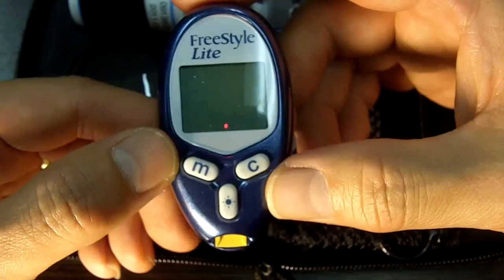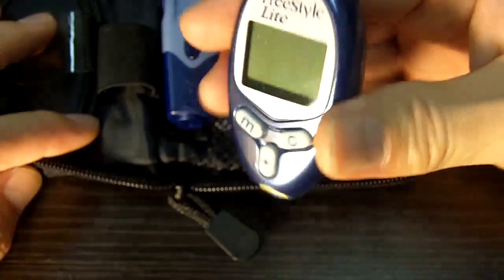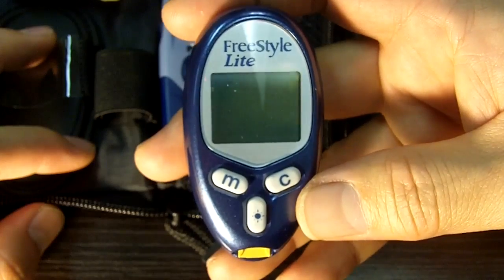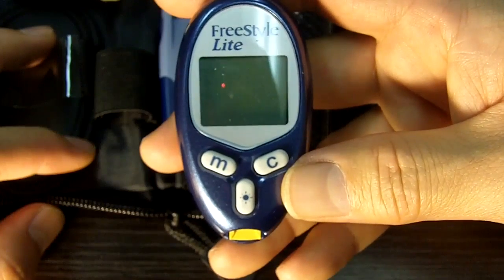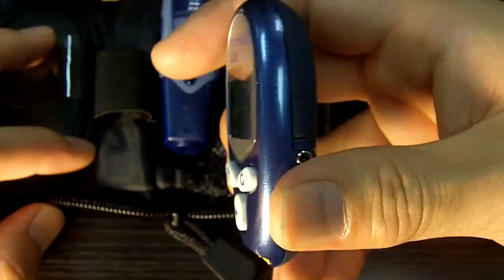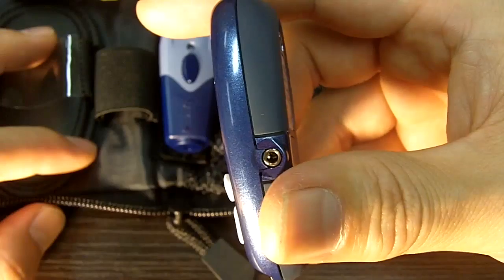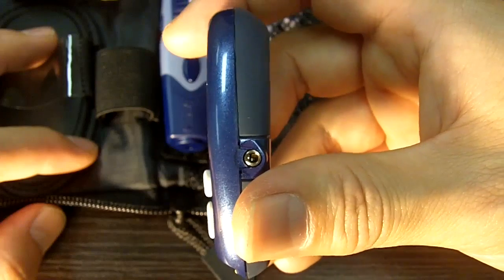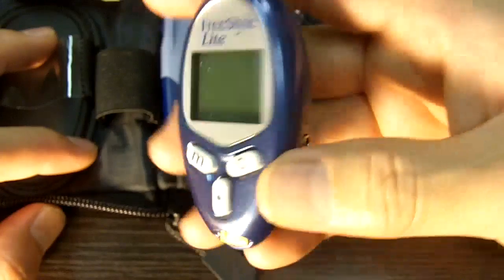For that reason, alternate site testing works really well on this meter. If you're doing the palm of the hand or the back of the arm, you may not get enough blood, but this meter takes such a small amount, so that's nice. It has memory, like all the other meters, maybe not as much as others, but it does. It also has a downloadable port on the side that'll connect to a computer if you have the software and cable. The software can be downloaded online, but the cable you'll have to purchase — probably under $20.